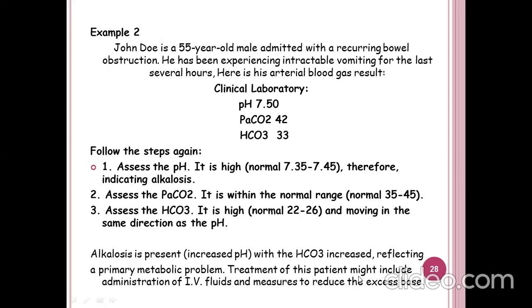Treatment of this patient might include administration of IV fluids and measures to reduce the excess base. So this is the treatment. If you provide a quality report to the patient, prepared in a proper manner, the clinician gets confirmation from the report and can treat the patient. Once the patient gets proper treatment, the patient may survive. That is how important ABG is.